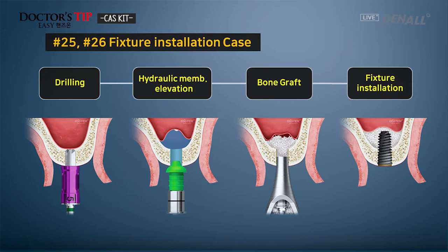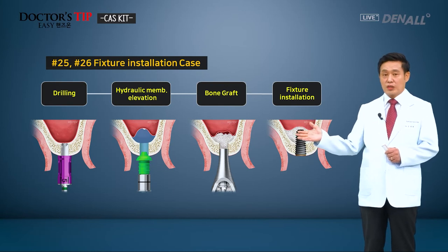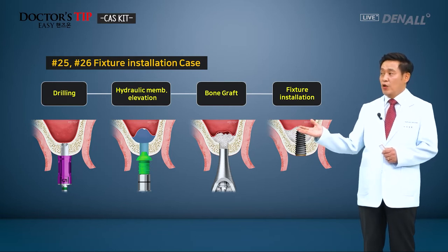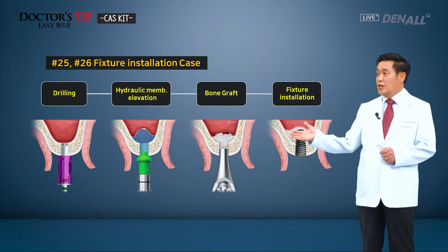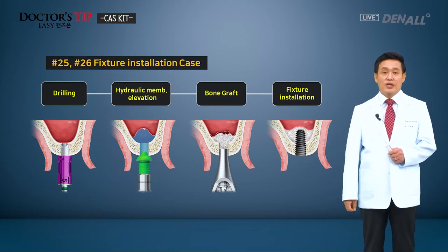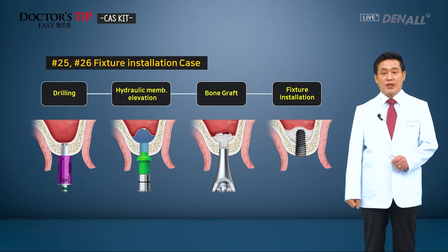In this model, number 25 and 26, two teeth are missing. As I explained, CAS kit drills will be used to penetrate into the sinus floor. After that, the hydraulic elevation tool will be used to safely lift the sinus membrane. After that, the bone carrier and condenser will be used for the bone grafting, and the fixture will be installed. Through this hands-on, you will be able to see this process. I'll come back to the hands-on. Thank you.